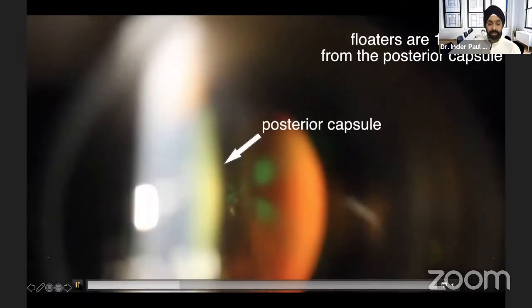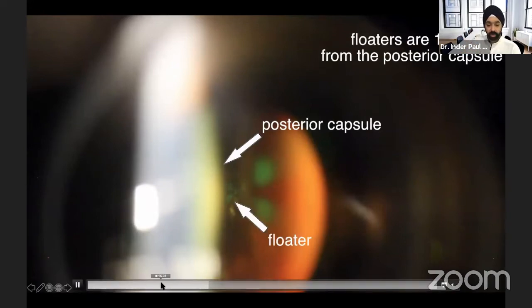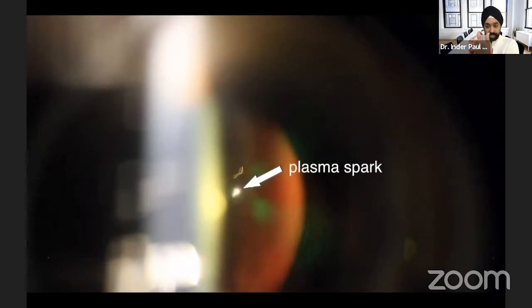But what I want to show you is, even at 6 millijoules or 5.5 millijoules, how efficient the laser is, and we did not break the capsule. And I want to show you something right here. There's a floater, there's a posterior capsule, and you can see now as I fire that I'm not breaking the capsule. I'm partially coaxial. I have a slight oblique so I can see the capsule there. But that's how efficient the energy is, even at 5.5 or 6 millijoules.